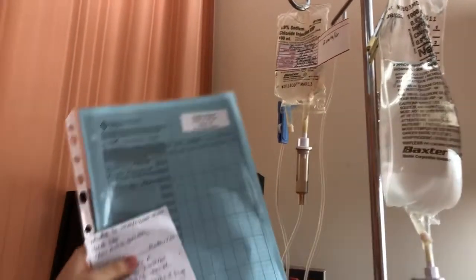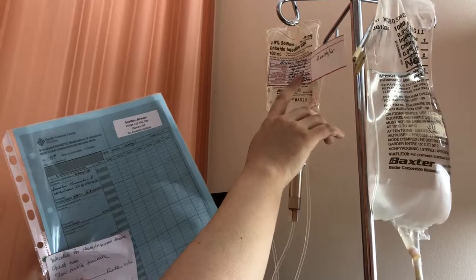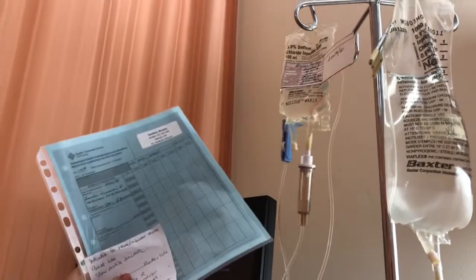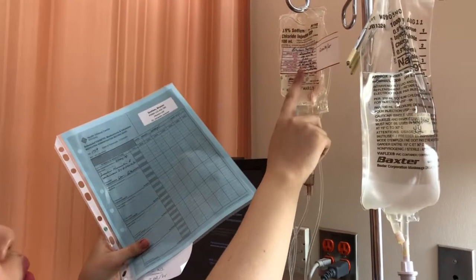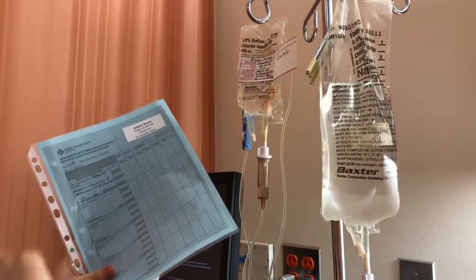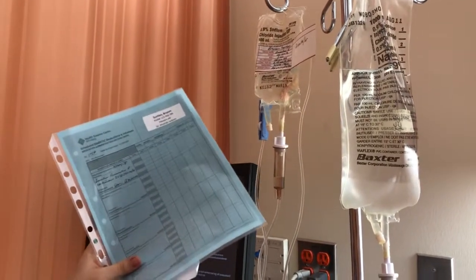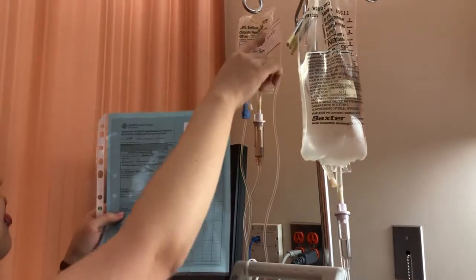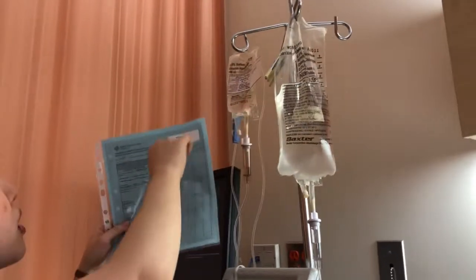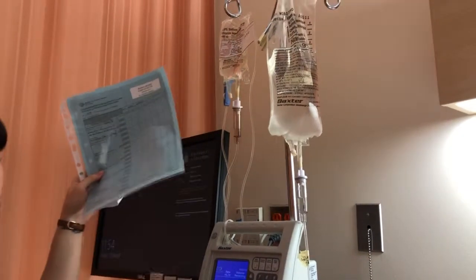As I calculated before, it's going to be 100 milliliters of normal saline mixed with 100 units of insulin, Humulin R. So the total volume will be 101, and it's going to be 2 milliliters per hour. And I'm going to check the right drug, right rate, right dose, and right time. Time is right now, and right route, IV.